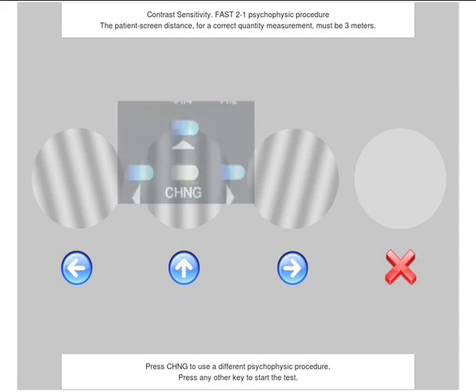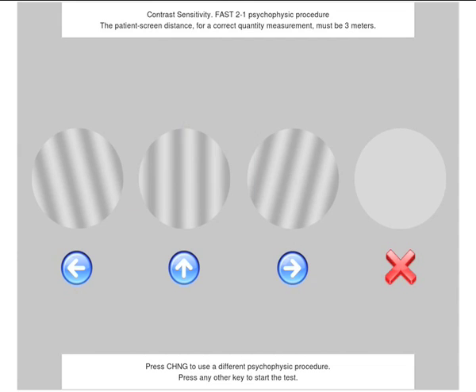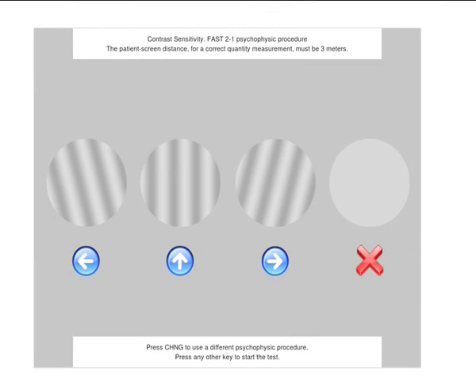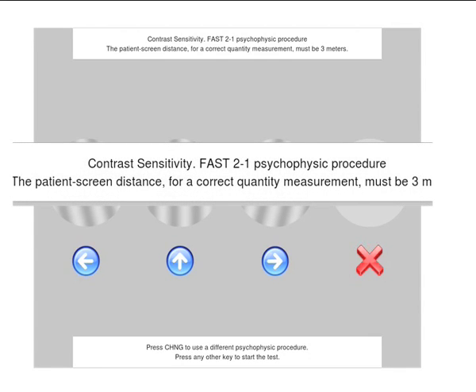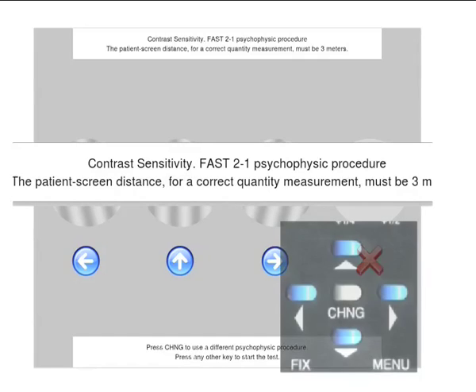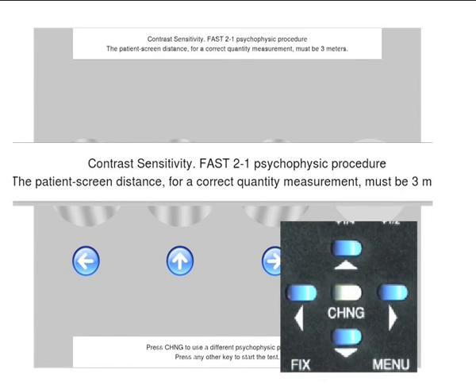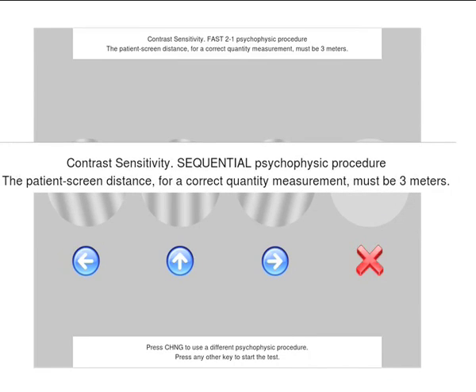Before starting the test, it is possible to choose the kind of psychophysical procedure to use. The test starts with the FAST 2-1 procedure, but if you press the change key, you can choose the sequential psychophysical procedure.